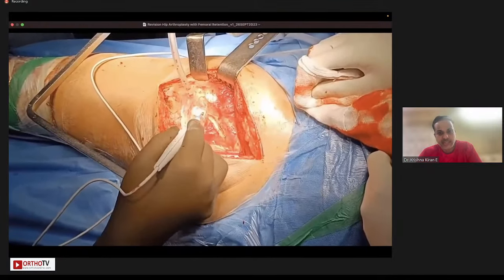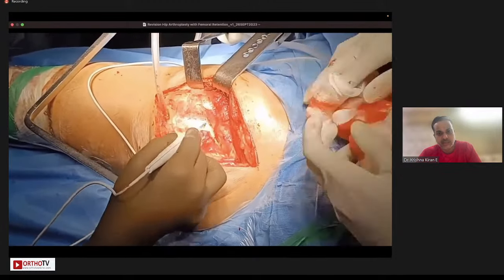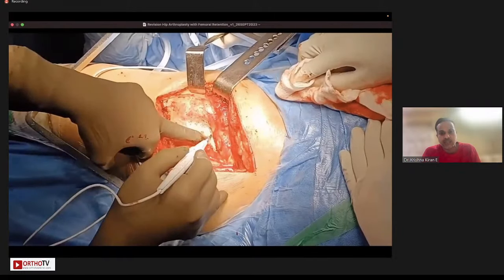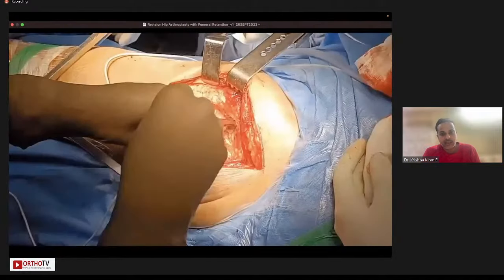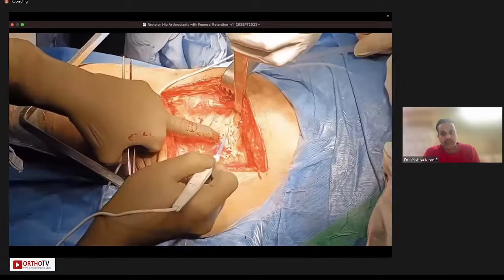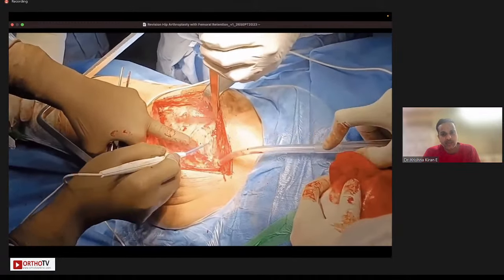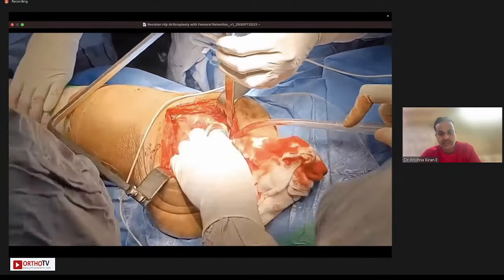The next step is to identify the posterior border of the abductor from the greater trochanter onwards at an angle of around 45 degrees and go along the posterior border of the greater tuberosity, that is the greater trochanter. And you put your spike inside underneath the gluteus medius to expose the minimus. And then the minimus is slowly separated out in the same line, which is an oblique line around 45 degrees from the tip of the trochanter.